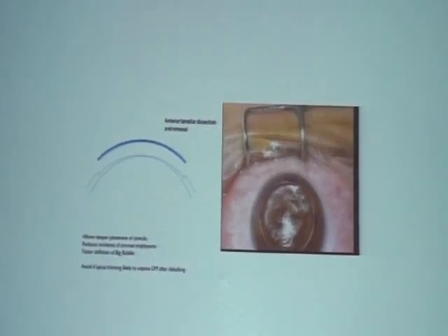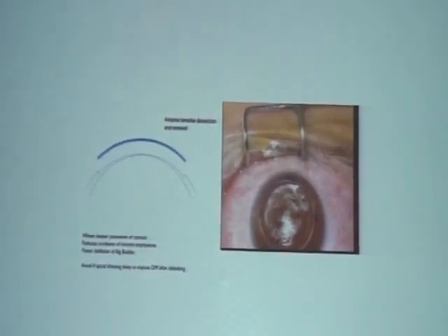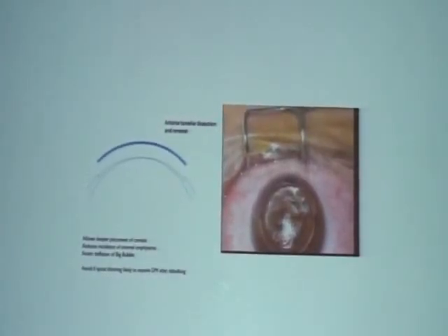The only thing is, if you have a very advanced keratoconus and your cornea is very thin at the apex, sometimes by doing this step, when you remove the anterior lamella, the apex of the cornea can have the Descemet's nearly exposed, and then when you try to create the bubble, the air, instead of finding its way posterior, starts coming out anteriorly. So on an OCT, if you see that the apical part of the cornea is less than 300 microns, then maybe you will not do an anterior lamellar keratectomy.